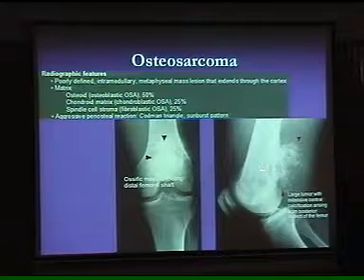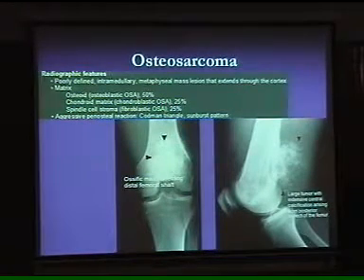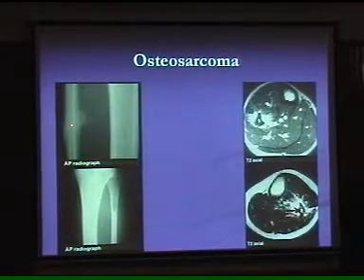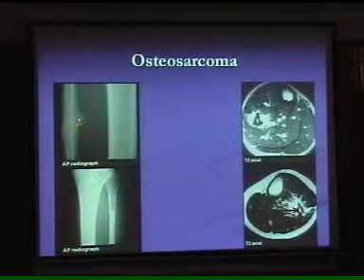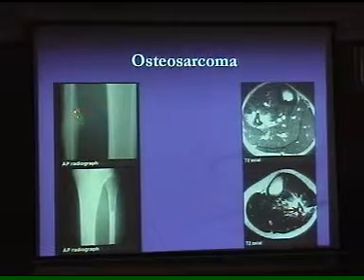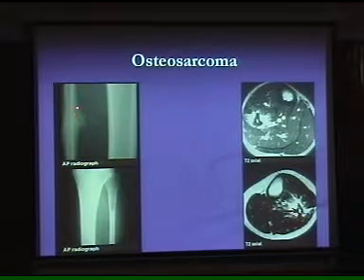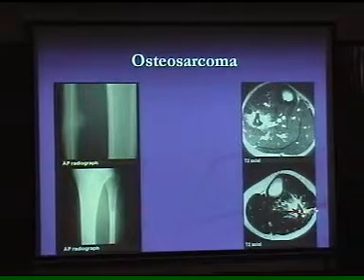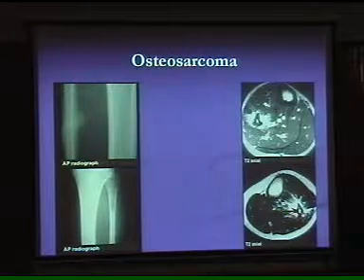Aggressive periosteal findings you can see: Codman triangle, sunburst appearance, exactly opposite to the main cortex, growing upside. If you look at this osteosarcoma, I'll show you the X-rays and how the MRI T2 weighted images look. In the X-ray of this lower limb, this fibula, you can appreciate a hyperdense, irregular, permeative lesion, because it's breaking the cortex and going into soft tissues. In the T2 weighted images, there are multiple areas spreading out in the form of spicules, bone formations, spreading into soft tissues.